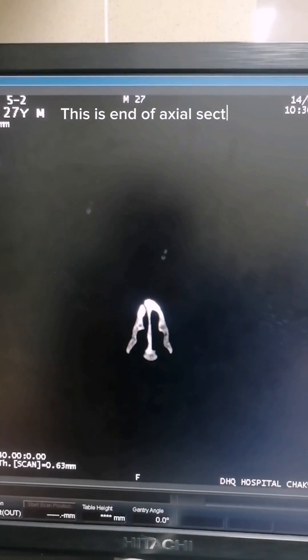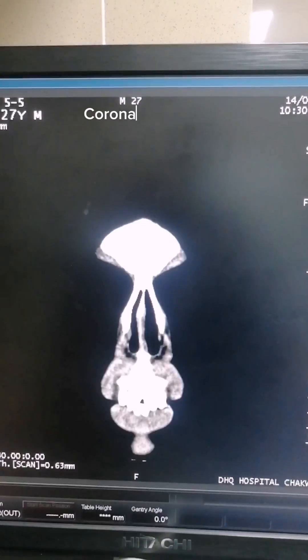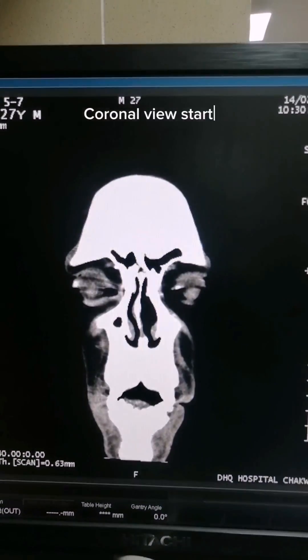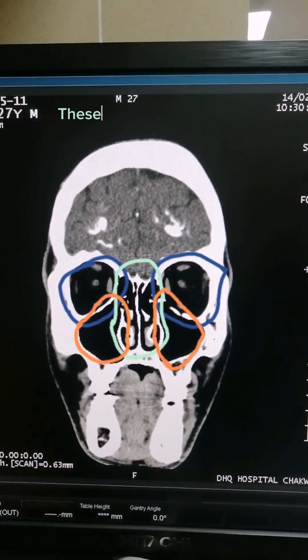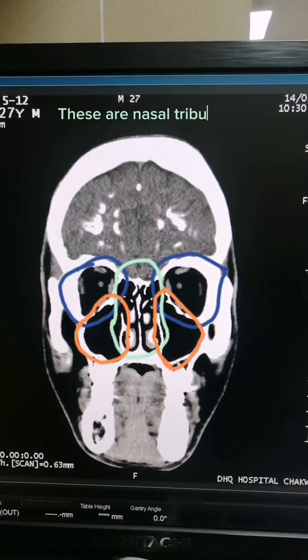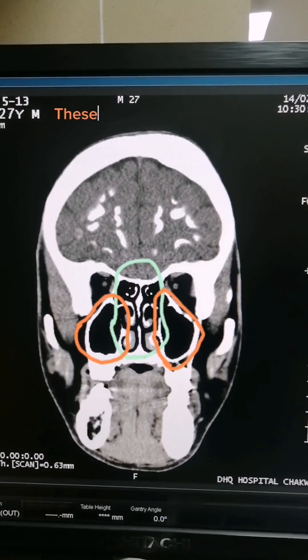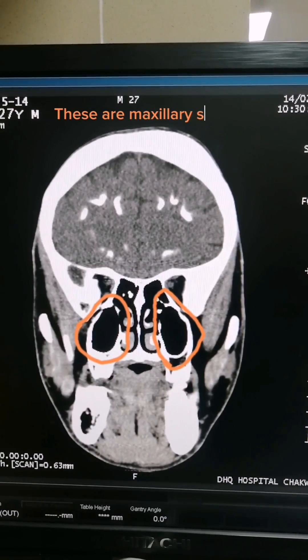This is the end of the axial section. Coronal view starts. These are the orbits. These are the nasal turbinates. These are the maxillary sinuses.